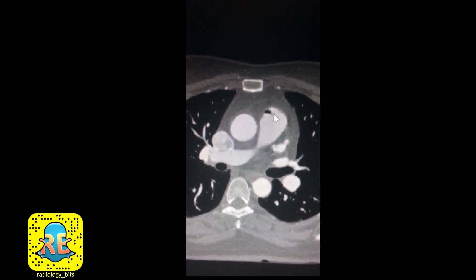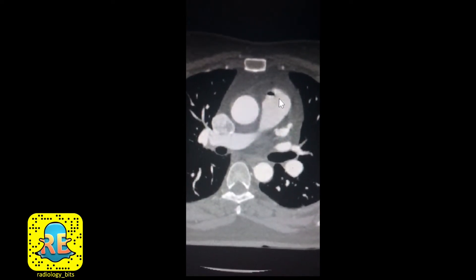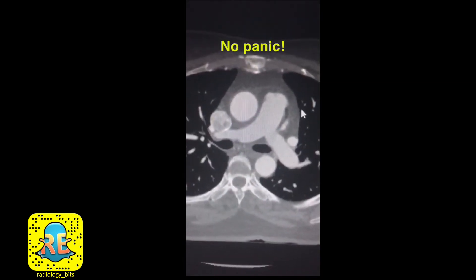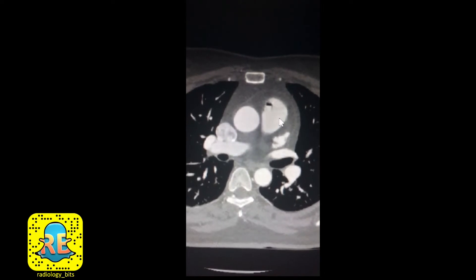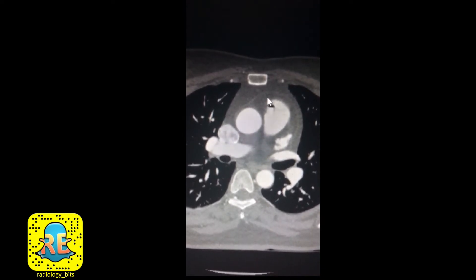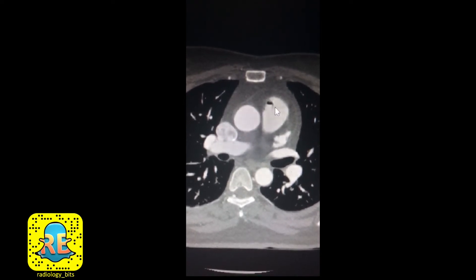This is all fine and well, but if you're seeing this for the first time — let's say you're a junior radiology resident doing your first night of on-call cases — what should you make of this? Well, one thing you should do is not panic and call this an air embolism. It is normal to see occasionally a few air bubbles within the right-sided circulation. This is because many patients have IV cannulations, so the IV cannula — whether inserted for injecting intravenous contrast or for other medical reasons — sometimes introduces a few air bubbles into the vasculature.